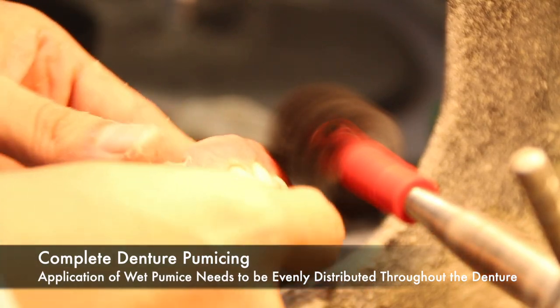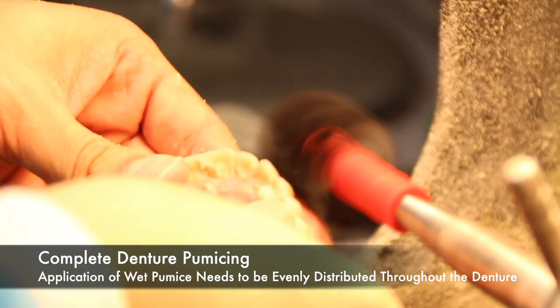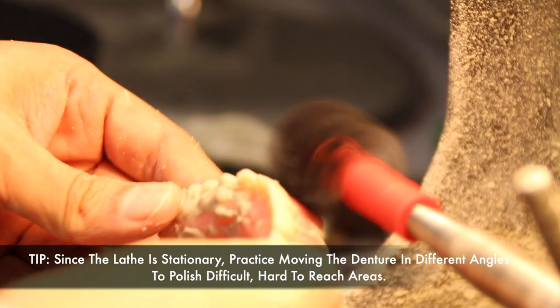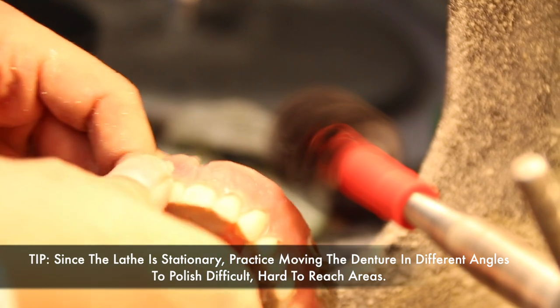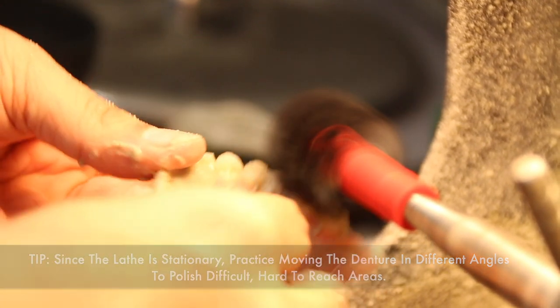The application of the pumice needs to be evenly distributed throughout the entire denture. All surfaces of the denture should be touched with pumice and a bristle brush. Sometimes this is easier said than done. For those of you used to using a handpiece, using a lathe can be cumbersome. A lathe is stationary, so you can't move around the denture the way you would with a handpiece. So practice moving the denture in different angles to polish the difficult hard-to-reach areas.